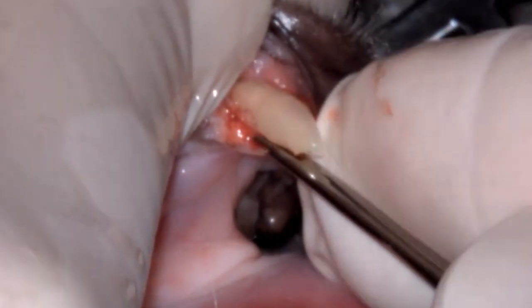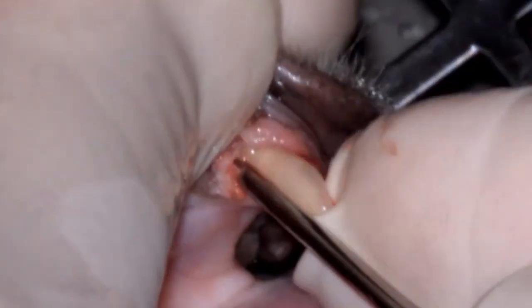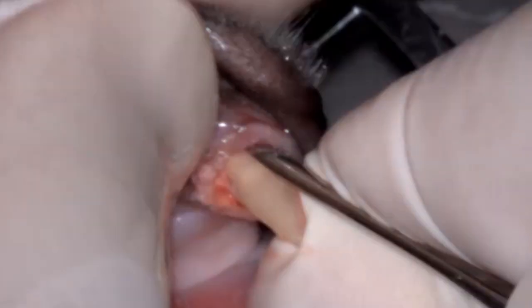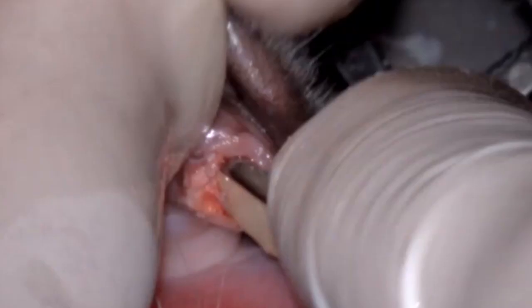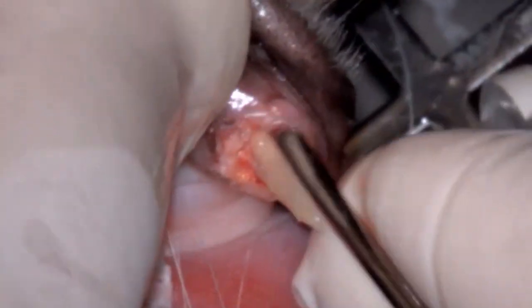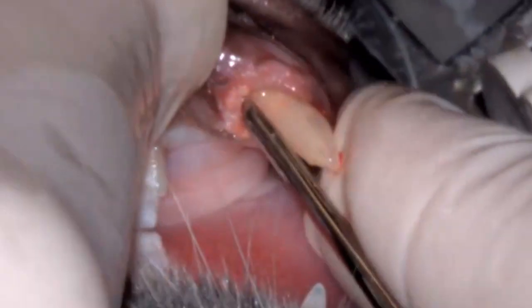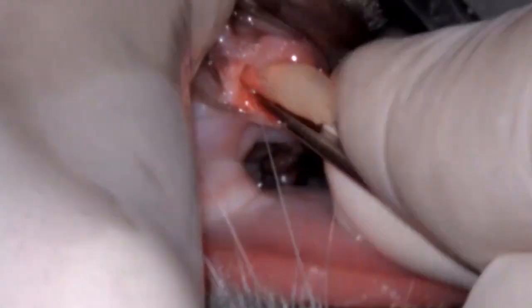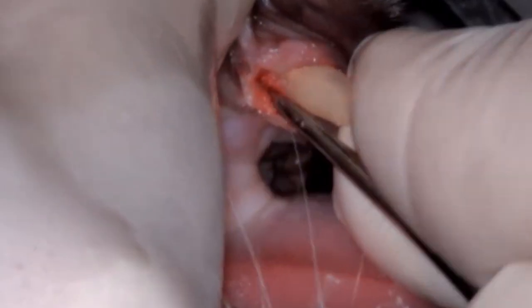Given that this is a tooth with endodontic disease, it has a contaminated root and septic inflammation around the root tip — this is a situation in which we can leave no remnant of the root behind. This tooth needs to be extracted completely. If it comes out in one piece, fantastic. If it breaks down, we have to go and get all of the remnants out. This is absolutely not a situation where we can allow for any intentional or even unintentional root remnant retention. This tooth has to be removed completely.